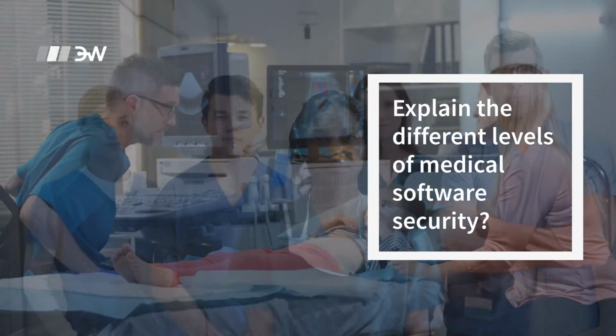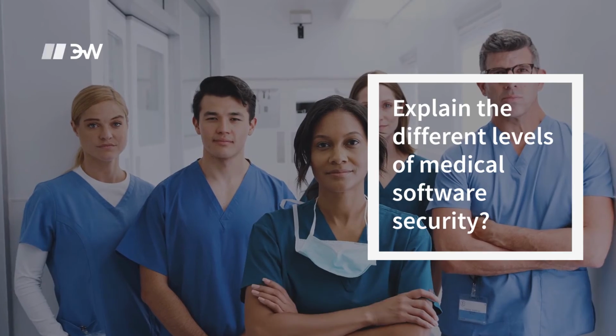Explain the different levels of medical software security. 62304 actually uses an ABC classification. Class A is the lowest level. Class C is the life-endangering level of safety and security.